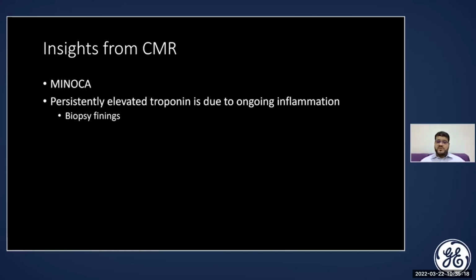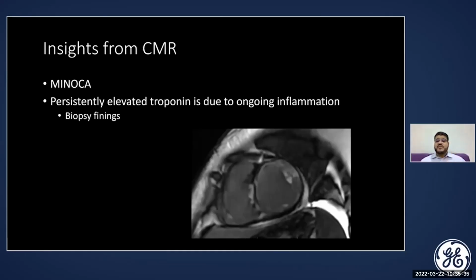What about the biopsy finding? Then we may be challenged by the fact that biopsy, which is the gold standard for looking for inflammation, is negative, and therefore maybe we are overestimating the edema and inflammation in her case. But again, MRI gives us a further insight into why this patient had a negative biopsy.